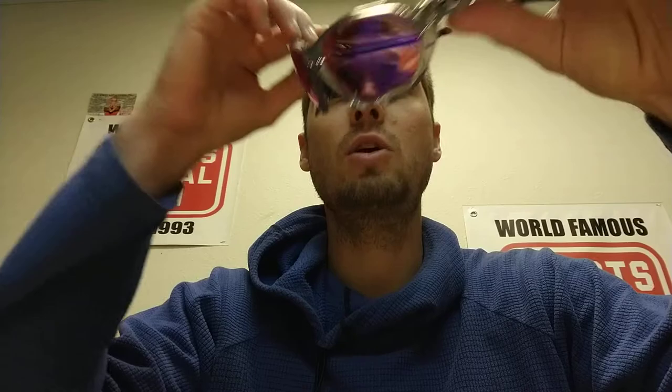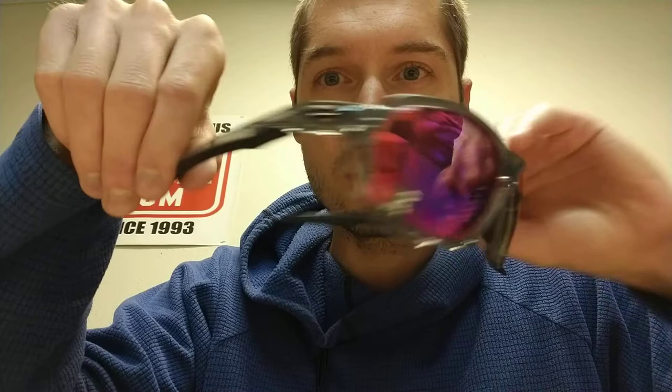So it fits me pretty well. We tried it on Emily here, who has a smaller head — works well for her too. So that's kind of how it fits. It's a cool looking frame; I dig the style.